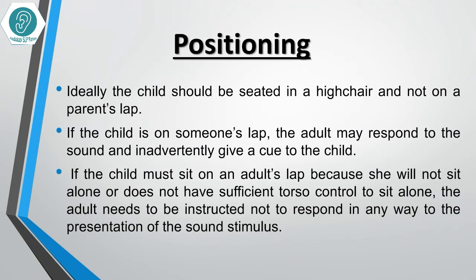The child should not be seated on a parent's lap, as the adult may respond to the sound and inadvertently give a clue to the child. If the child must sit on an adult's lap, the adult needs to be instructed not to respond in any way to the presentation of the sound stimulus.